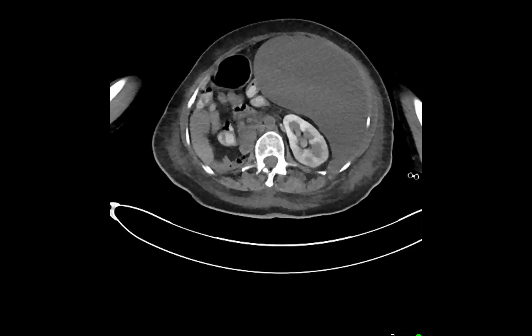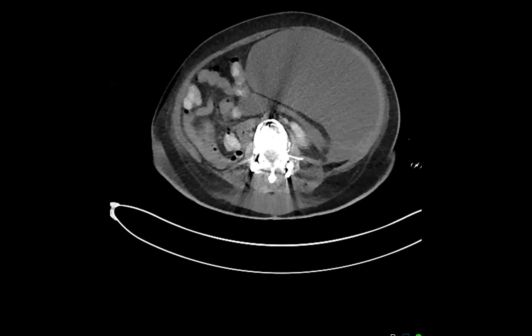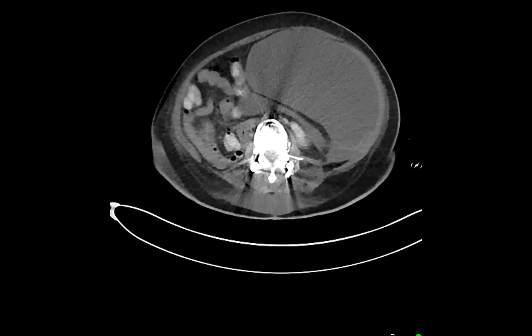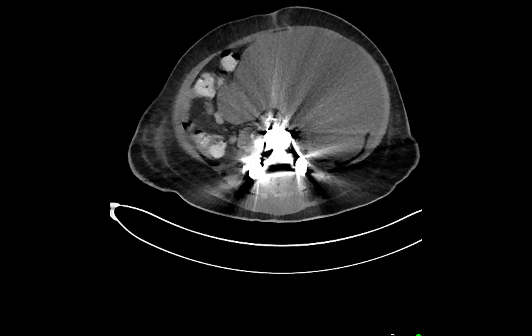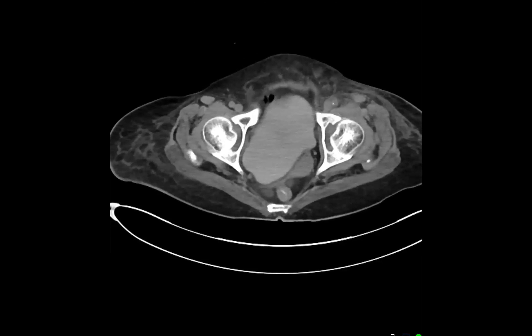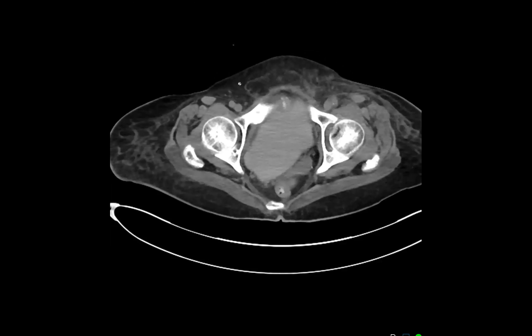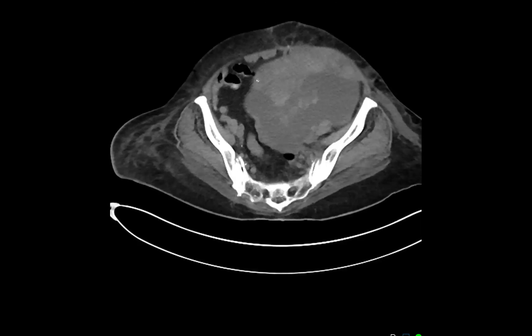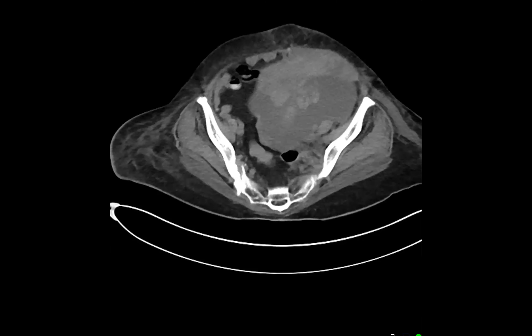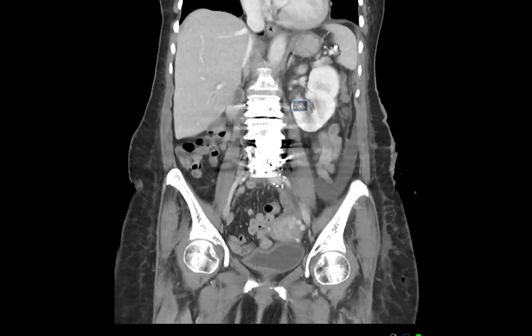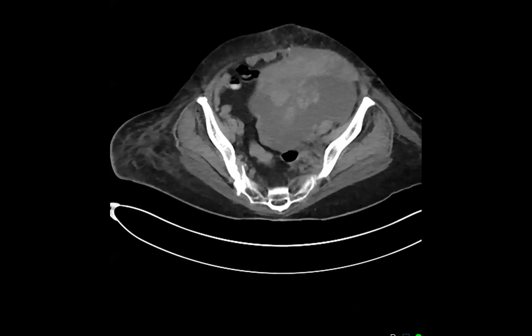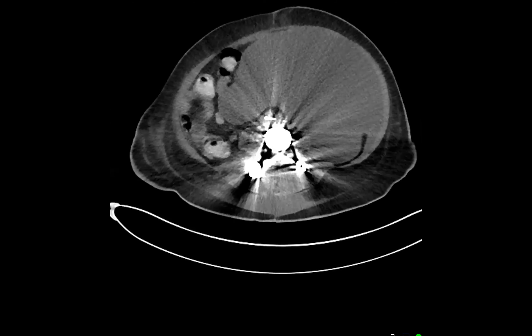The first question is: where is this collection located? Looking for the colon to see if it's retroperitoneal or intraperitoneal — it looks like the colon is pushed all the way to the right side, even the descending colon. So it's likely retroperitoneal, but it also looks like it might be touching the ovary. Since the descending colon is a retroperitoneal structure in the anterior pararenal space, and this thing is pushing it anteriorly, it definitely looks retroperitoneal.